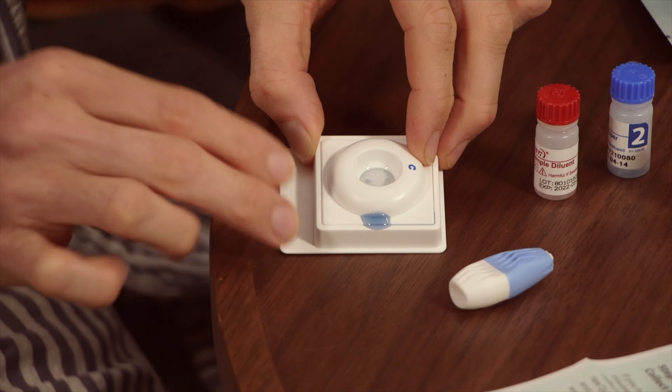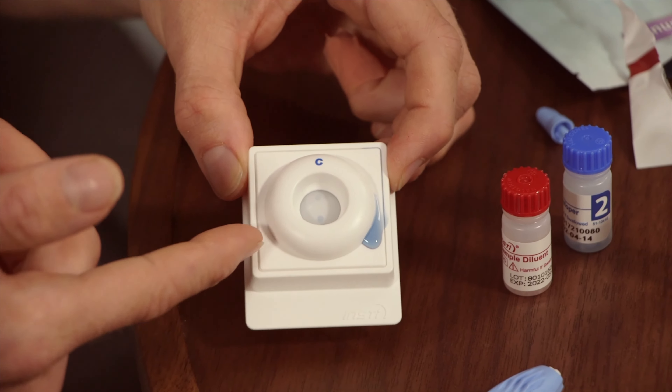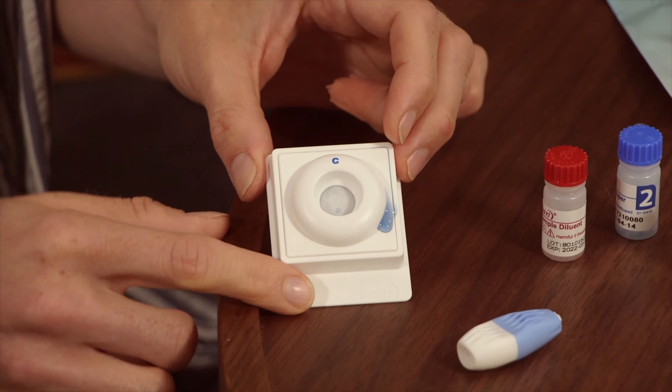I think I know what I'm gonna get. As you can see, two dots. She's positive — HIV positive. The top dot might look a little faint, but as long as it's visible, the test is valid. And if you have one dot, you're HIV negative. So pedestrian.